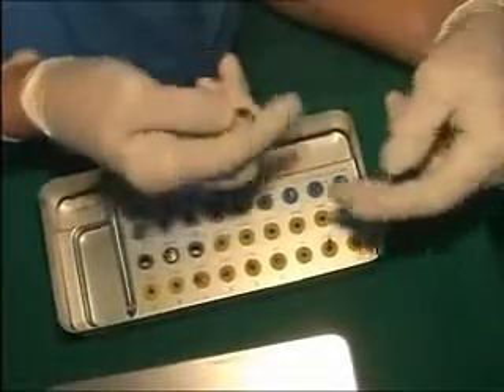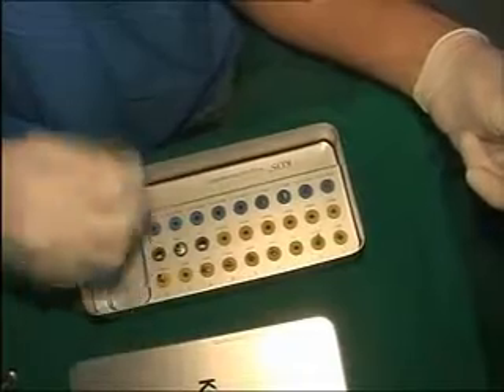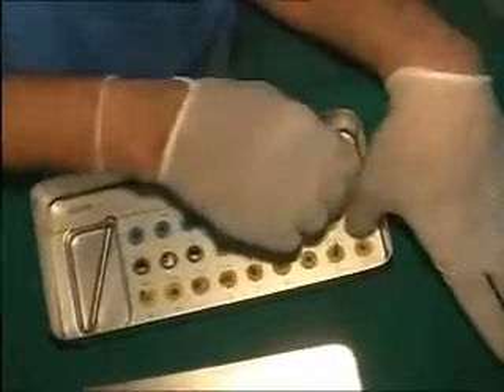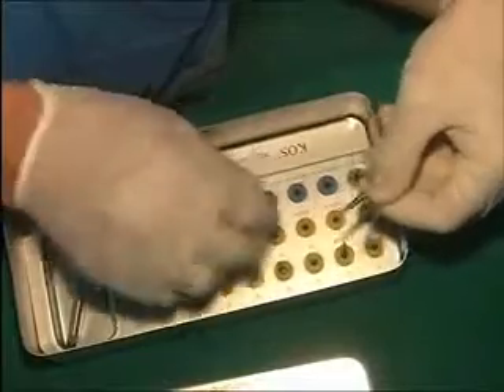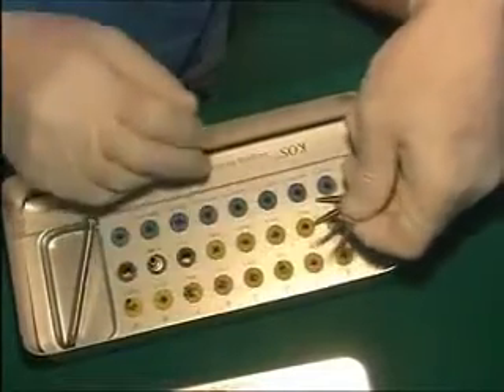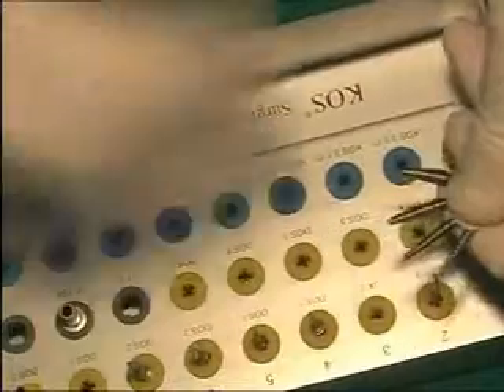The kit also has a drill extension. The drill has a ratchet and the kit has 4 bone expansion screws: 3, 3.7, 4.1, and 5. Never fight with the bone — use the bone expansion screw.